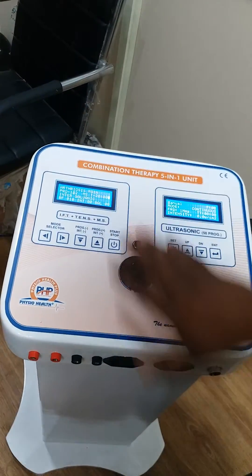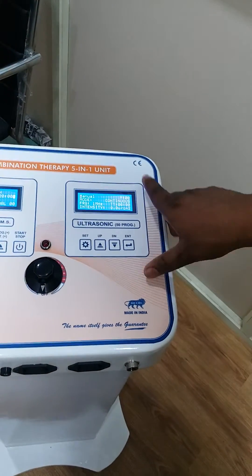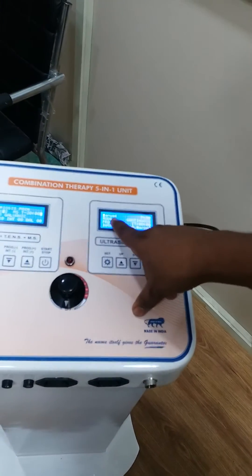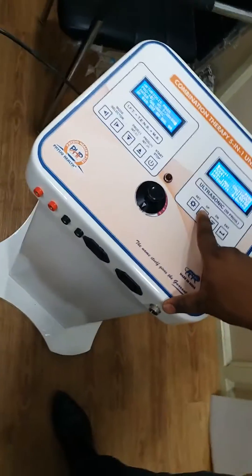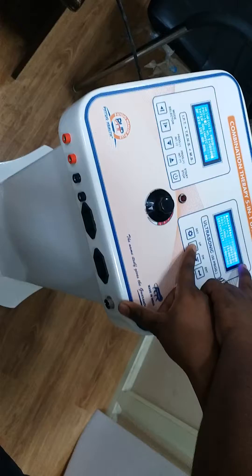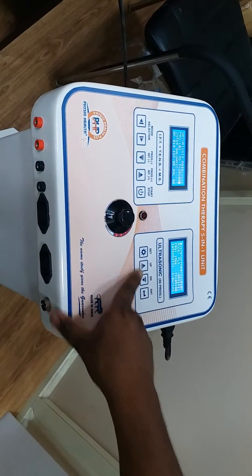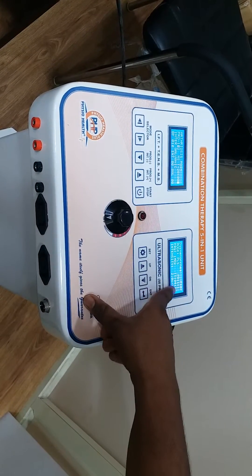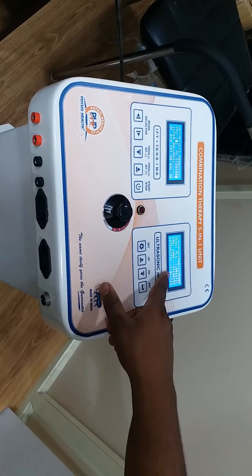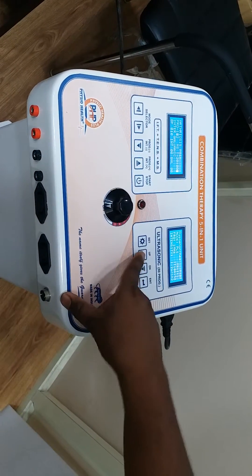Here is the ultrasonic machine, which has 50 programs. You can change the program manually — program number one, program number two, program number three — and select the program according to the patient. Then start; the start time decreases and you select the intensity accordingly, for example 1.4, 1.2, and increase as needed.